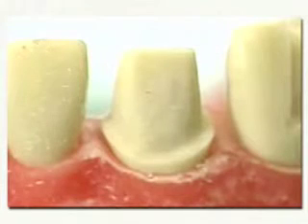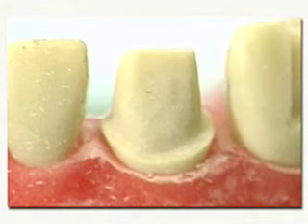The completed preparation should be evenly tapered with an incisal reduction of approximately 2 millimeters. The preparation should be smooth and should follow the anatomy of the tooth.